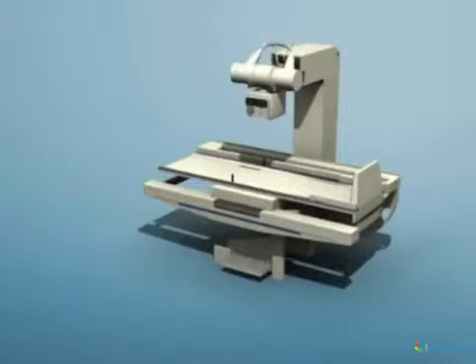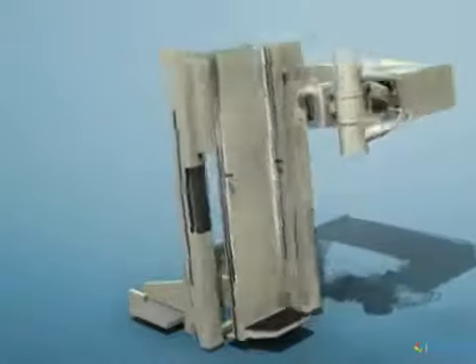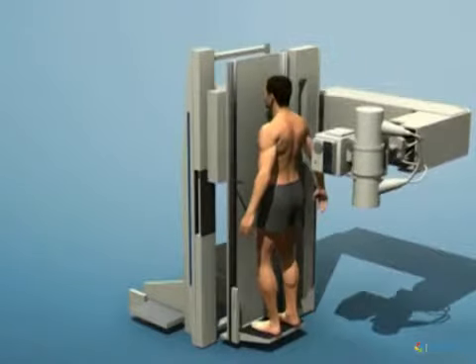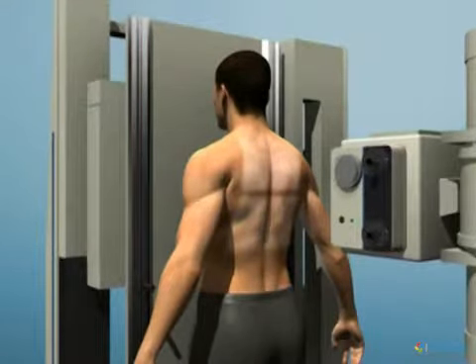The apparatus is made up of an X-ray emitting tube, an examination table, and a receiver that contains the radiographic film. Let's take the example of a chest X-ray. The patient is standing, chest against the examination table, which is in a vertical position. The X-ray tube is placed behind the patient. It projects a marker of light that enables the correct positioning of the emitter.